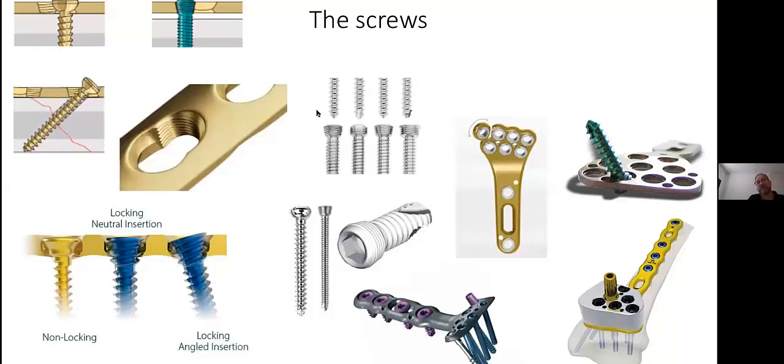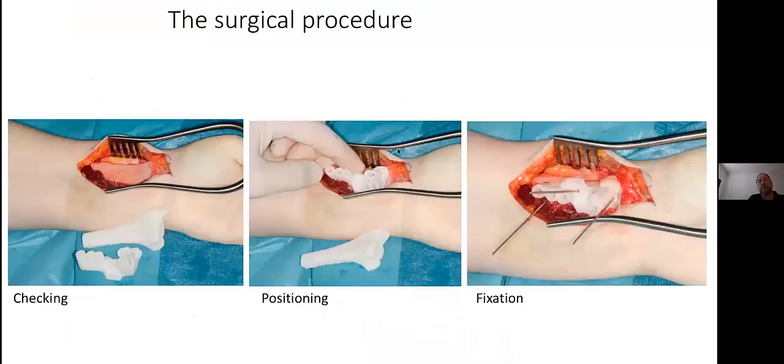And there are other things too, different kinds of points and screw heads materializing in the plates where the screw grips. And as I said, you can angle them, or you can have small guides here for the drilling. So they are actually quite advanced, and it's good to know how they work when you use them.